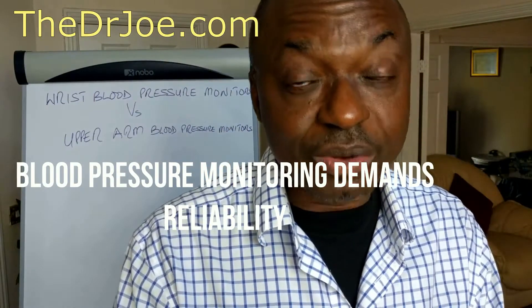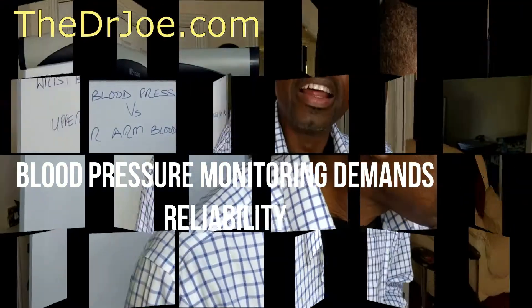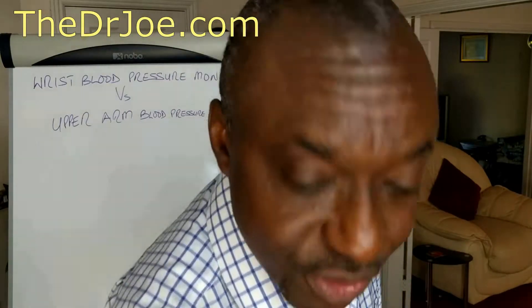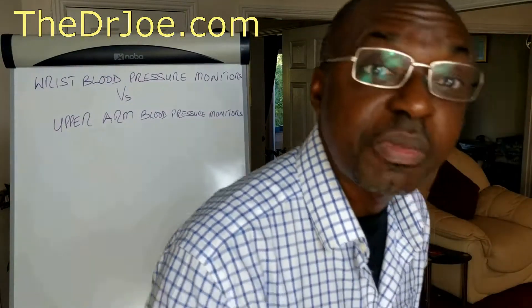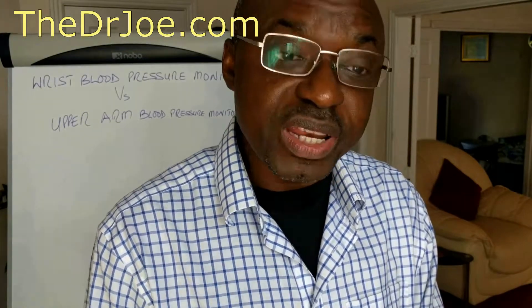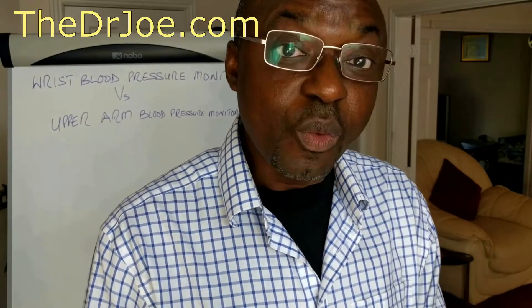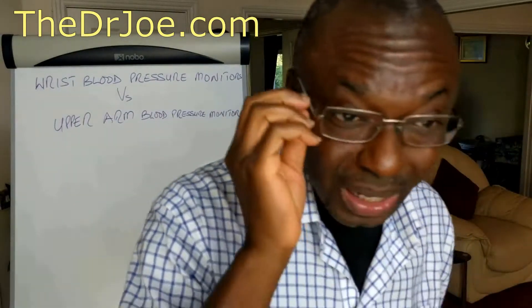There is a very big doubt about wrist blood pressure monitors as far as accuracy is concerned. Just to underscore the point about accuracy, let me give you an honest review by a customer from that popular retailing website. This customer wrote: 'I'm really disappointed with this product. The readings were widely off compared to my doctor's blood pressure monitor and it was dubious to say the least. I want to return this product and get a full refund.' That's what I call an honest review.